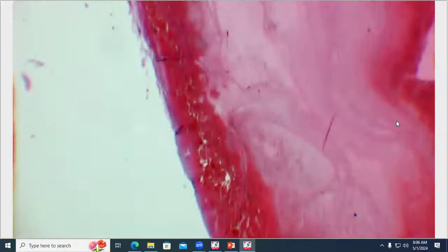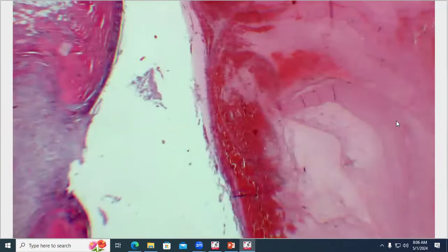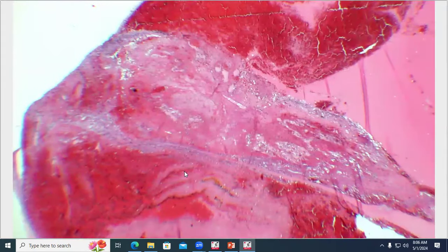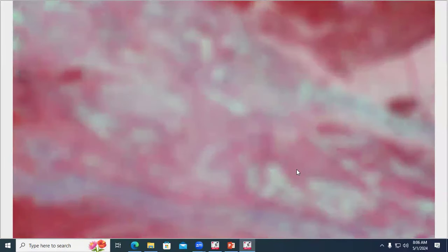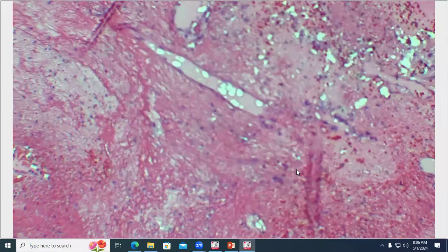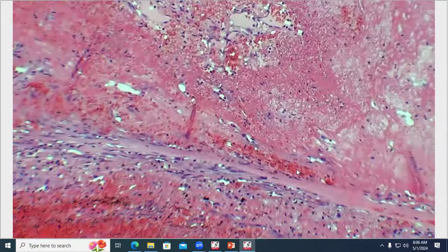And then the main event here is the retina and what's going on around the retina. We have a cupped and atrophied optic nerve to your left, but let's focus in on the retina here. So we have detached retina coming up through here, and we have all this pinkish stuff next to it. If we look closer at what this pinkish stuff is, we have fibrin and hemorrhage and spindle cells and blood vessels sort of organizing all of that fibrin and hemorrhage.